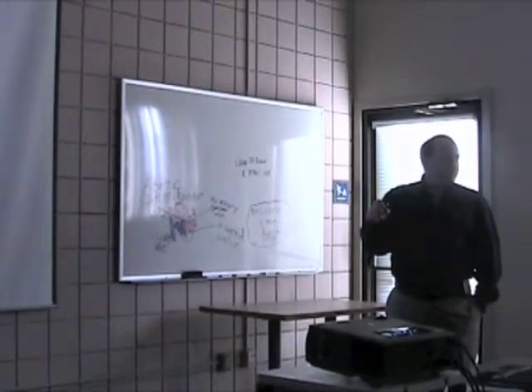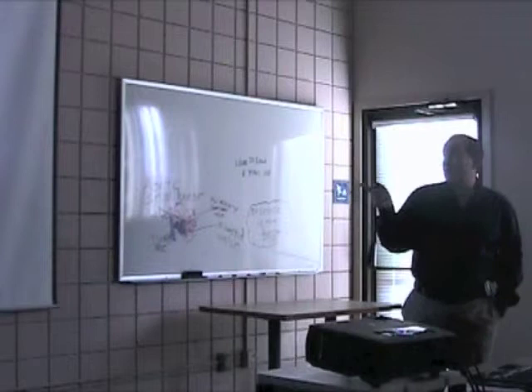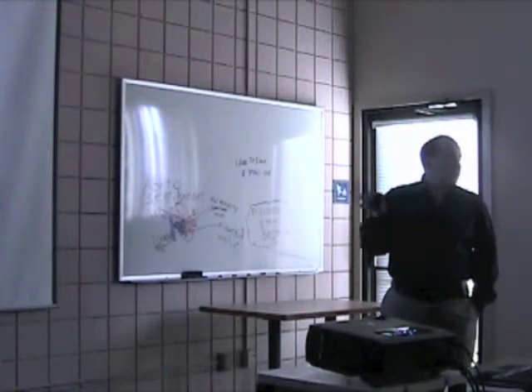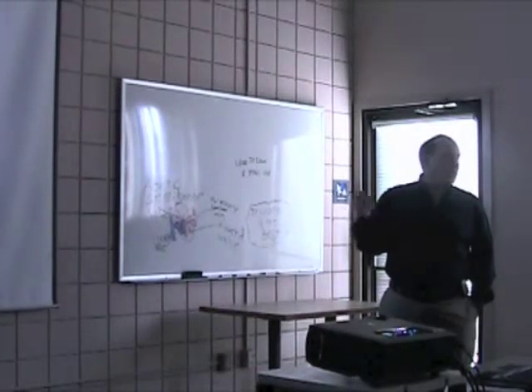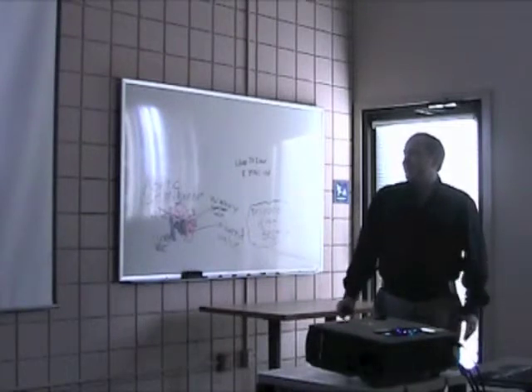Does a pig valve last? About, the current ones are probably 12 to 15 years. In anticipation that the use of life may extend over the next few years with the improvements in technology? With the valves, yes. And in fact, that's why the current ones are up to about 12 to 15 years. 10 years ago, average was about 6 years. That has to do with that fixation that they do. In addition to the glutaraldehyde, they have this other material that inhibits calcium formation. And they're all proprietary. Every company, Edwards will tell you that it's better than Medtronic and that sort of thing.